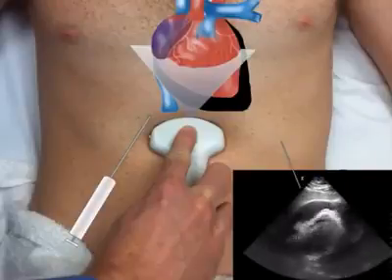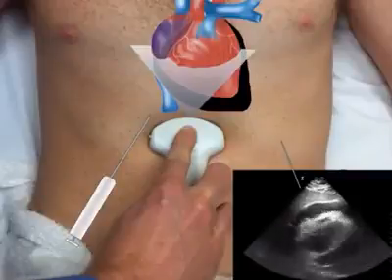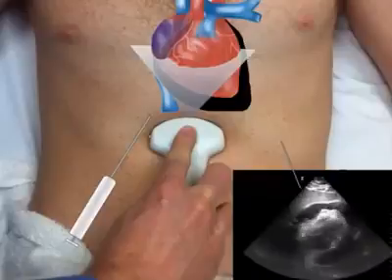This is an example of performing an ultrasound-guided pericardiocentesis from the subcostal window. The steps that we mention here are pretty much the same steps that you would use for the apical window, the only difference being the orientation of the ultrasound probe. For this particular example, we're using a curvilinear abdominal probe. However, you could also use the thoracic or phased array probe for this particular image.